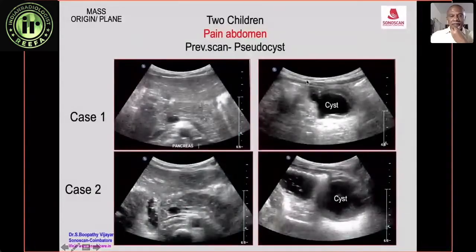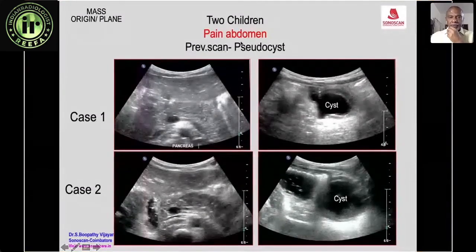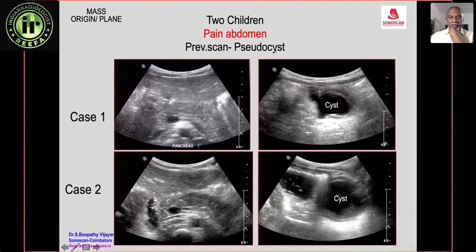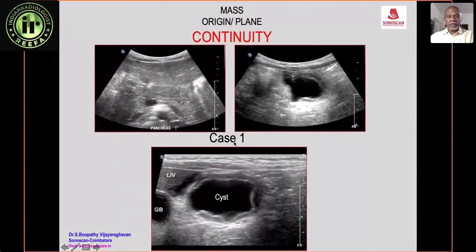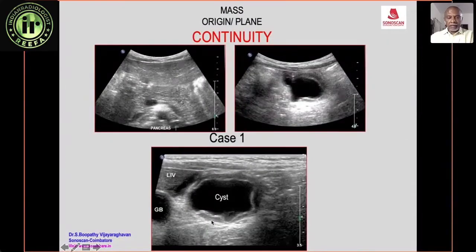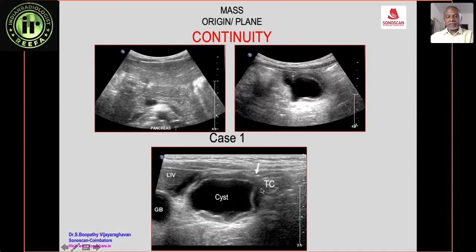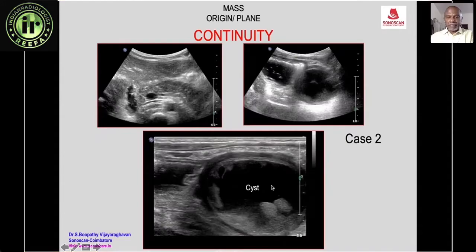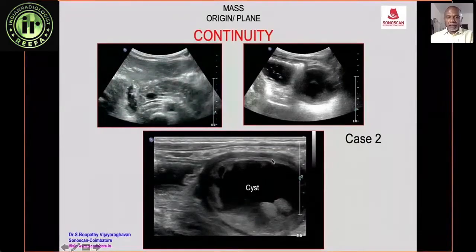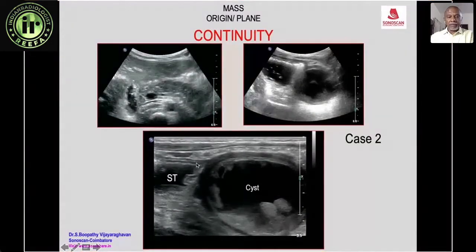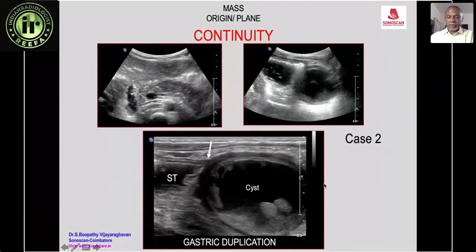To illustrate the continuity sign, two children presenting with pain abdomen are shown — both previously reported as pseudocyst. In Case 1, high-frequency imaging shows the liver, gallbladder, cyst, and gut signature in the cyst wall indicating a duplication cyst. The transverse colon wall and cyst wall are continuous, confirming a duplication cyst of the transverse colon. In Case 2, the cyst again shows gut signature, but here the stomach wall and cyst wall are continuous — confirming a gastric duplication cyst.